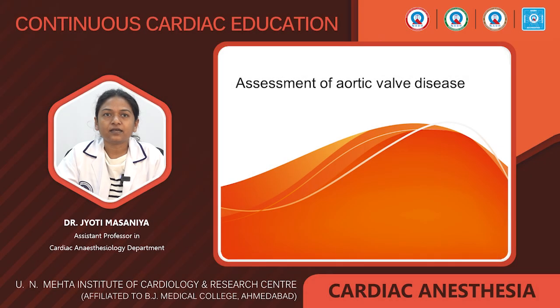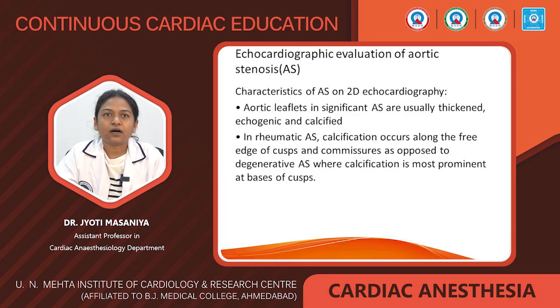Good morning, everyone. Today's topic is assessment of aortic valve disease by transesophageal echocardiography. First, we will discuss the echocardiographic evaluation of aortic stenosis.